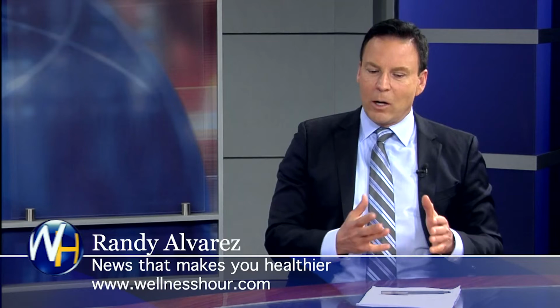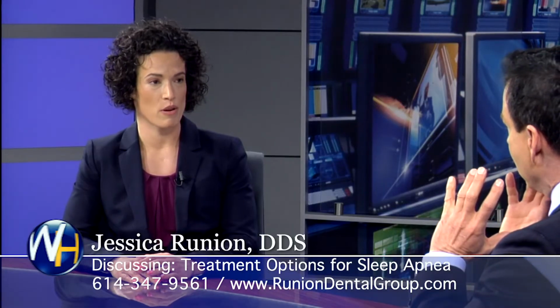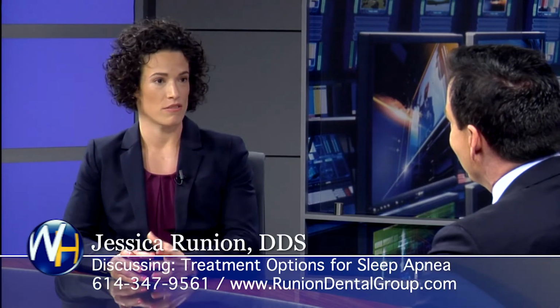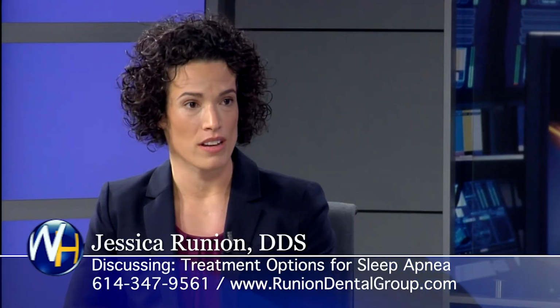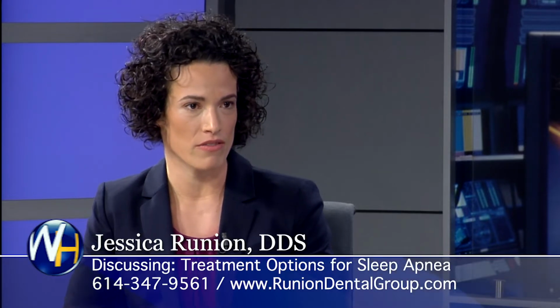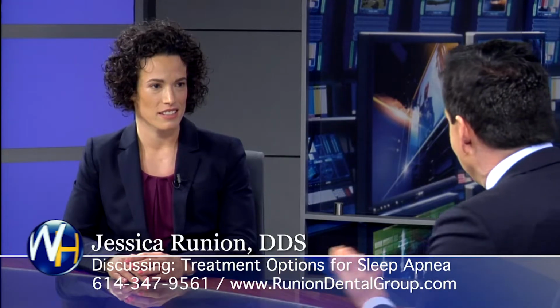So I understand this correctly: people with sleep apnea breathe fine all day long, but when they lay down, their tongue's dropping back, their jaw's dropping back? It's both, actually. The airway is a certain diameter, and naturally people sleep on their back, which most people do. So if they sleep on their back, their airway gets smaller because their tongue and their jaw go backwards, creating a smaller airway and inhibiting the amount of air and oxygen they need while they sleep. So you just open it up? Correct. Is it comfortable? Actually, yes. They can sleep with it.